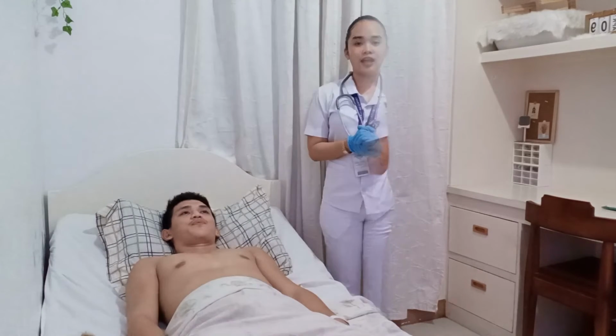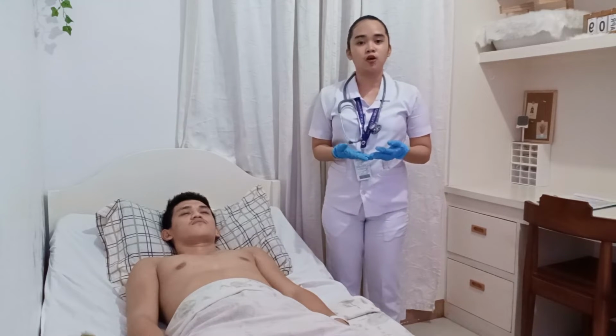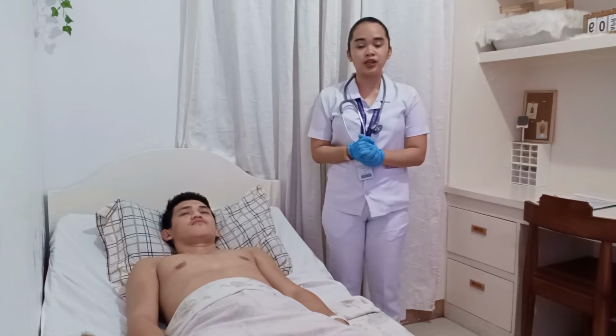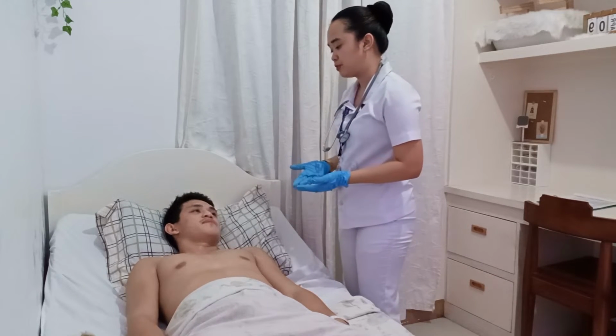Okay. Now, using the diaphragm of the stethoscope first and then the bell, auscultate the heart in all four anatomic sites for heart sounds, extra heart sounds, and murmurs. Ask the client to breathe regularly while auscultating. So, Mr. Patrick, I need you to inhale and exhale for me, okay?